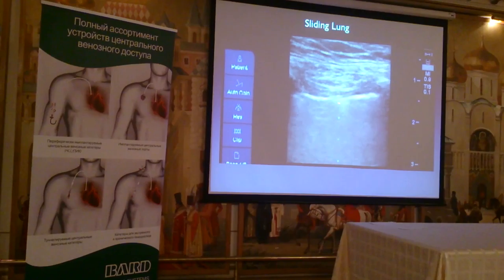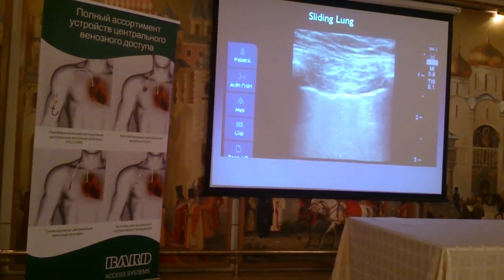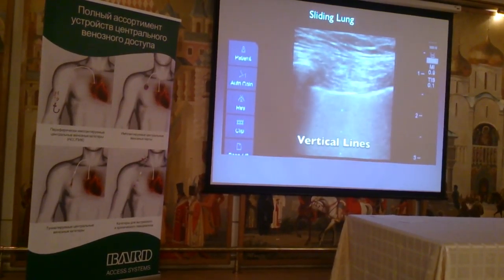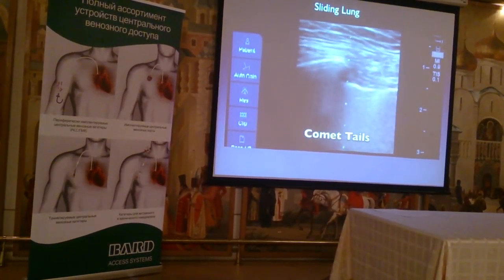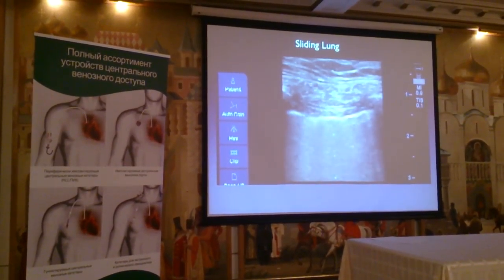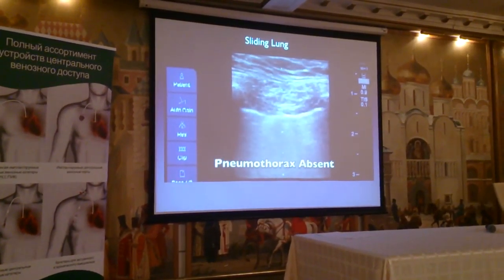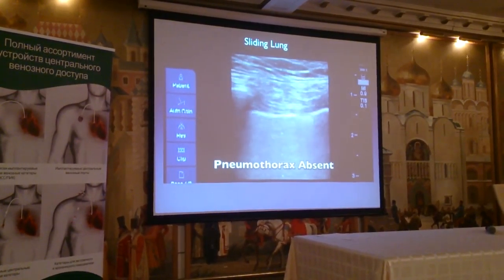We're going to push record. You can see it's a nice clip. Do you see those vertical tails? It's called a comet tail. This is better than a chest x-ray — the sliding lung sign demonstrates that there is no pneumothorax.